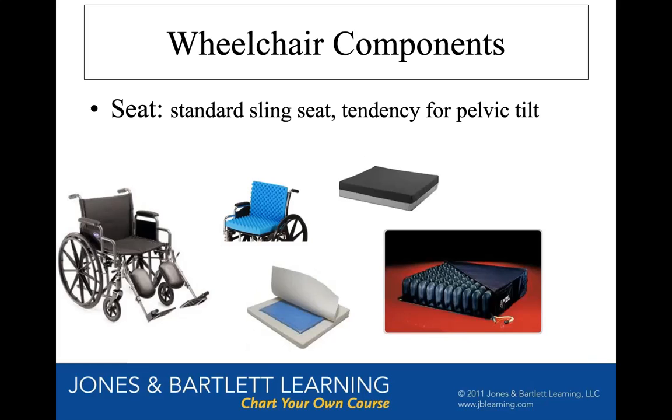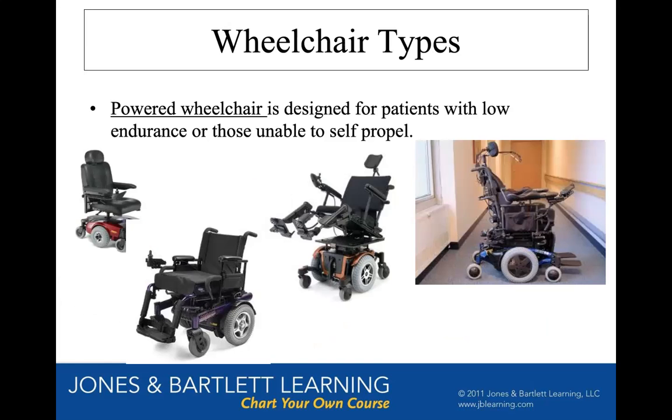Okay. So the sip and puff chair, because I just pulled up a video and I was trying to understand it. So is it different types of the way that they breathe out that moves the chair? Yes. The program is all computerized, but it's done with air pressure of the person blowing through the straw. So it's working through inhalations and exhalations, but it's all timed. Like how long your exhalations are and how long your inhalations are and how strong they are too.